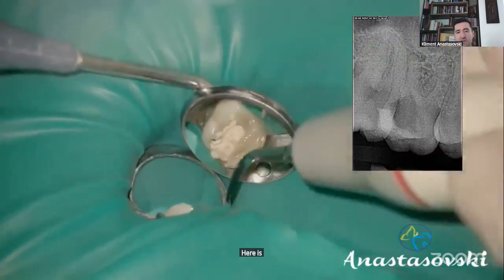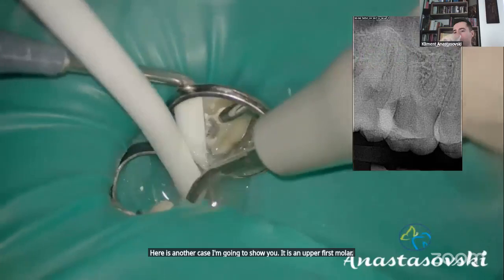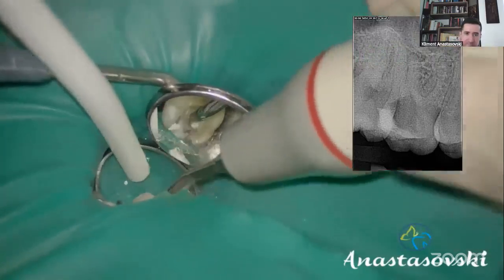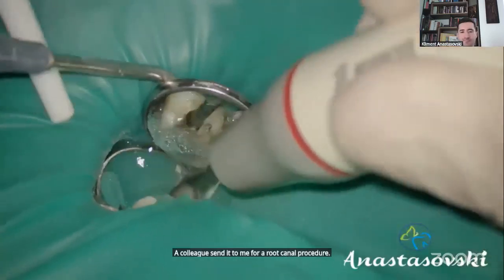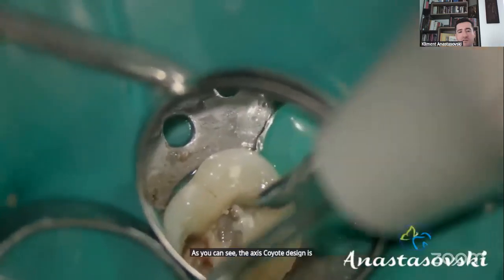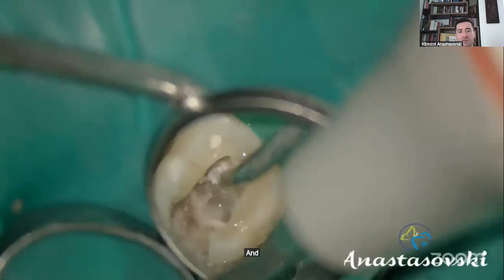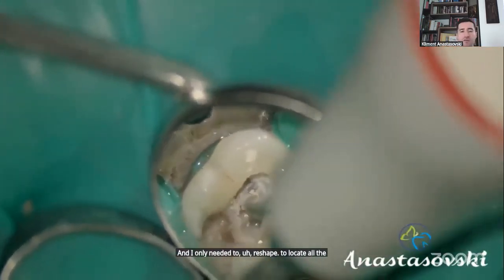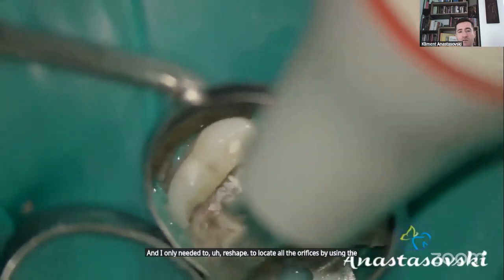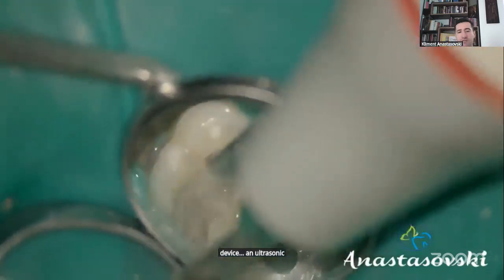Here is another case I'm going to show you. It is an upper first molar. A colleague sent it to me for a root canal procedure. As you can see, the access cavity design was already made by the previous dentist, and I only needed to reshape and locate all the orifices by using the ultrasonic device, an ultrasonic tip for this purpose.